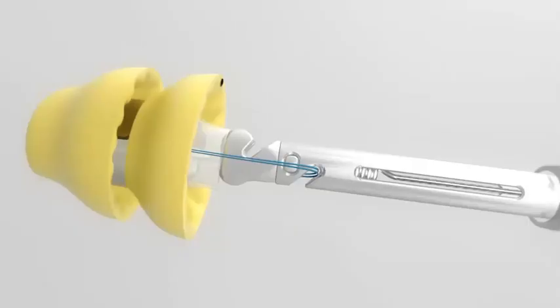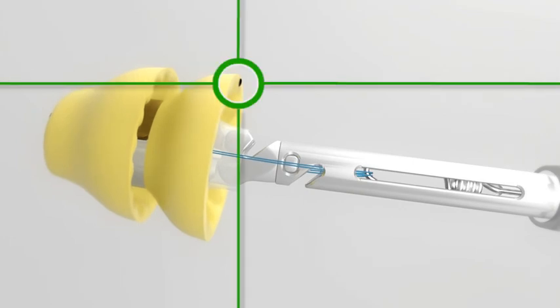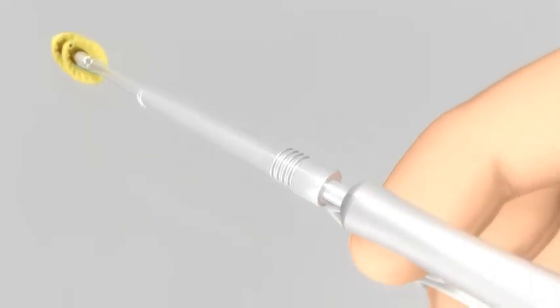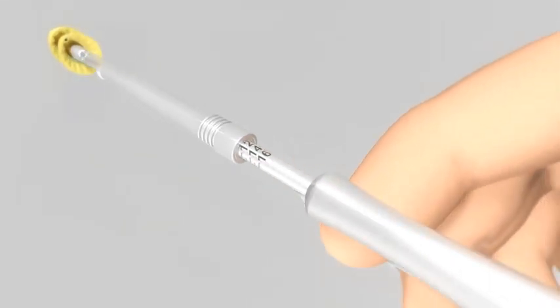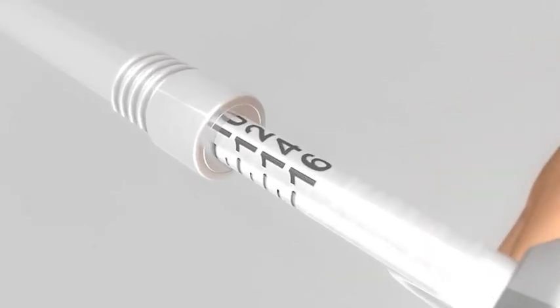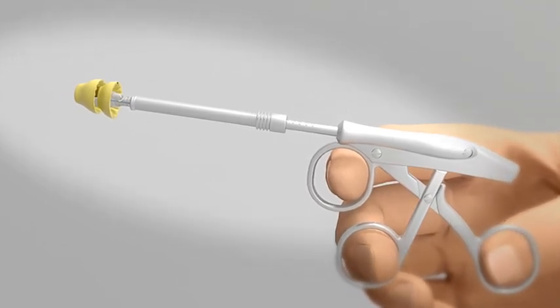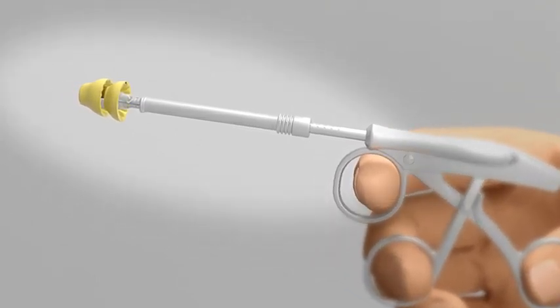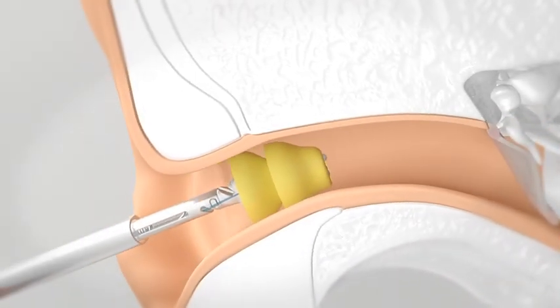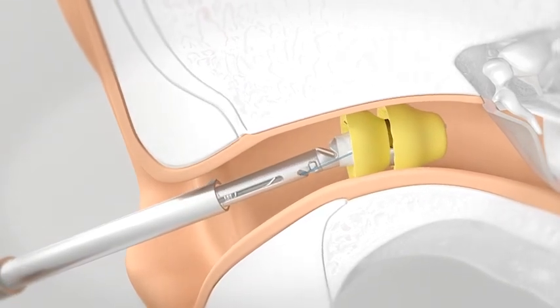When loading the device on the insertion tool, make sure that the dot on the seal is in the superior position. Set the correct insertion depth based on your previous measurement. In this case, it is 10 millimeters. Prior to device insertion, remember to reapply lubricant if necessary. The maximum insertion depth should be treated as a not-to-exceed value and is reached when the sliding depth ring lines up with the posterior meatus.